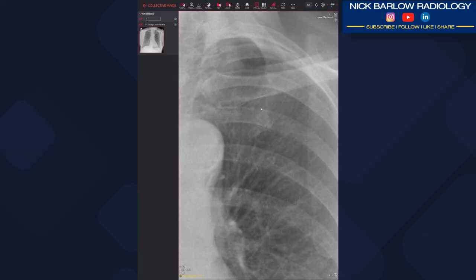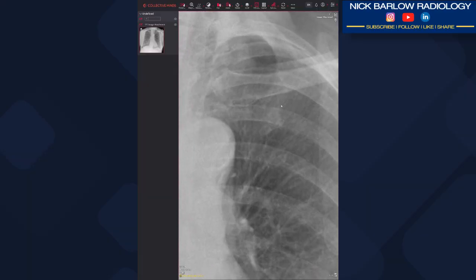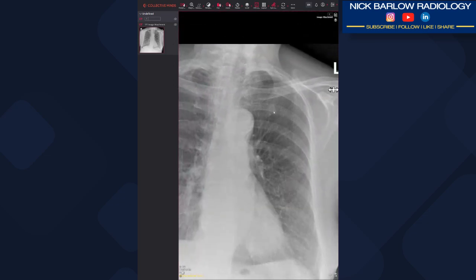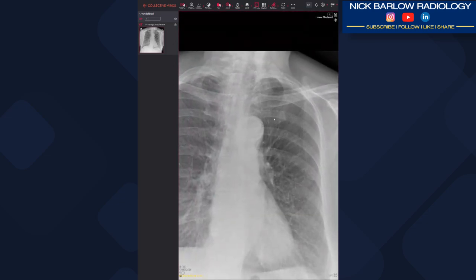This one is a little bit more irregular and a little bit more fuzzy. Unfortunately the patient doesn't have any previous X-rays. So as I say it's likely to be costal cartilage. It could be superposition of vessels and ribs, but unfortunately lung nodules like to be sneaky — they like to hide.